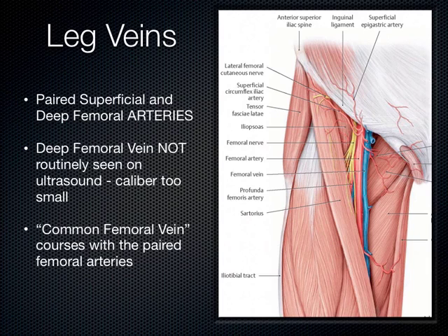Essentially, you've got that in the inguinal area up there, sometimes called the inguinal canal, right along here. This is the inguinal ligament that's going along here, okay? You can see some muscle bellies here. But this orientation: the femoral nerve, and then the femoral artery, and then the femoral vein is seen medially to it. And the way I remember that the vein is more medial than the artery is the rhyme: venous rhymes with penis. Good, venous penis. Someone, you heard that one already. So you could say venous vagina if you wanted to too. But that's because sometimes people say other things. I think that's just easy to remember, kind of rhymes, that the most medial structure would be the vein.